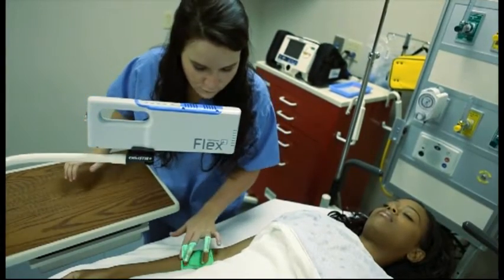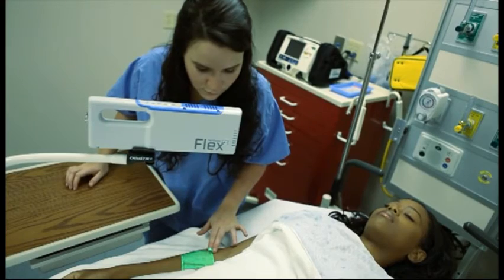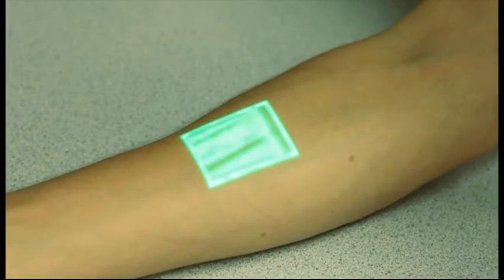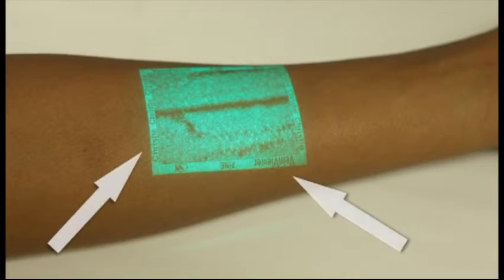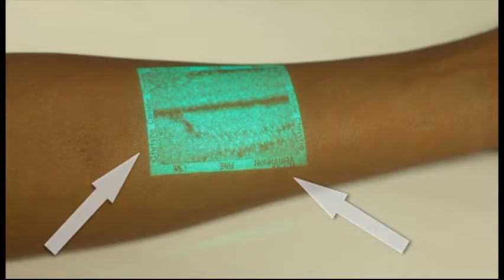To achieve proper focal distance for VainViewer Flex, hold the unit close to the surface of the skin and move the unit away until the border text around the image reading VainViewer and Christie becomes clear and legible.